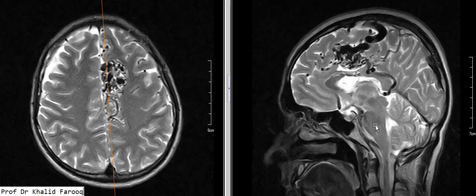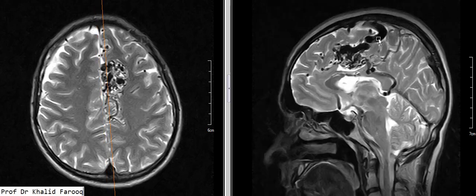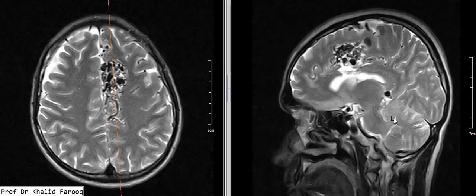We can see this vermiform low signal intensity area involving the medial portion of the left parietal lobe just above the corpus callosum. This is basically an AVM which is being supplied by vessels from the anterior cerebral arteries and is being drained through cortical veins into the superior sagittal sinus and the vein of Galen, immediately below the splenium of the corpus callosum.